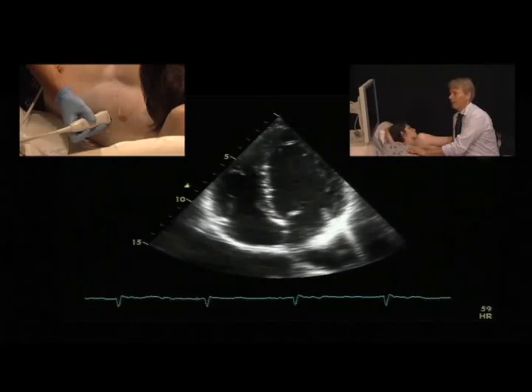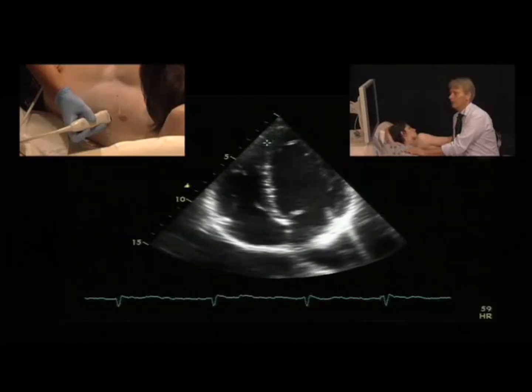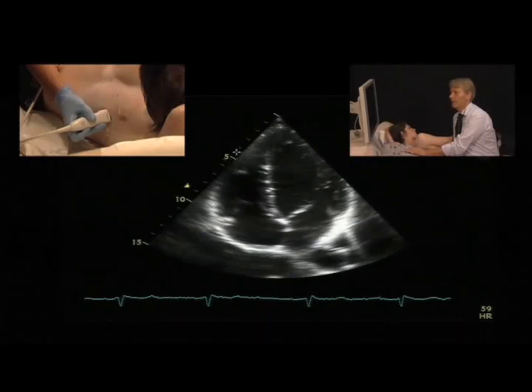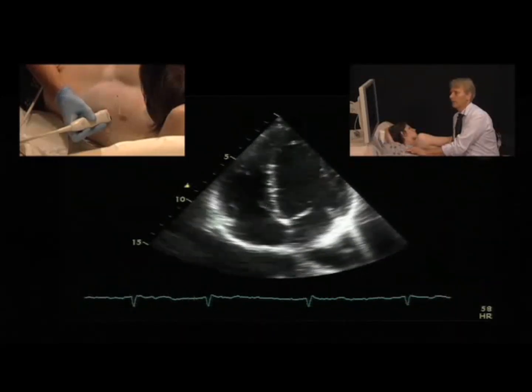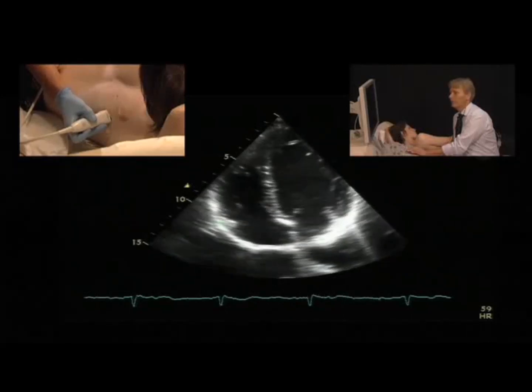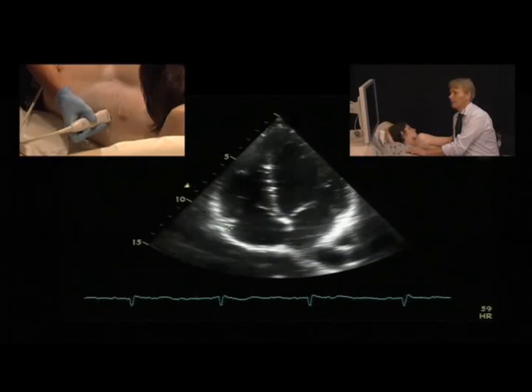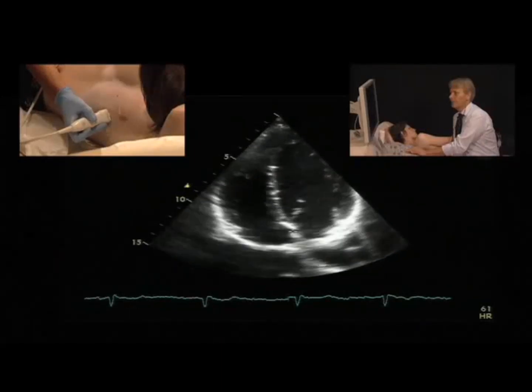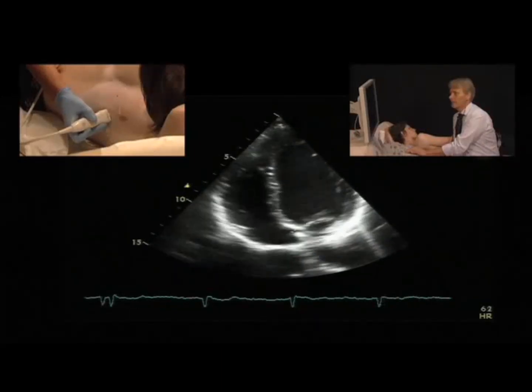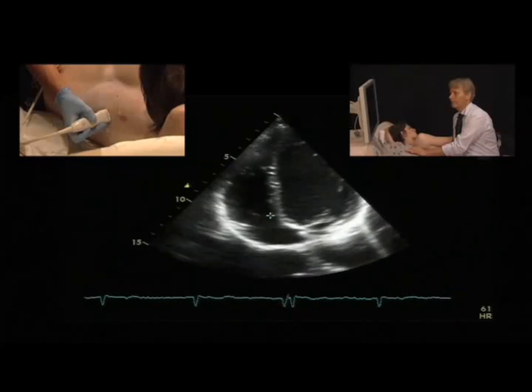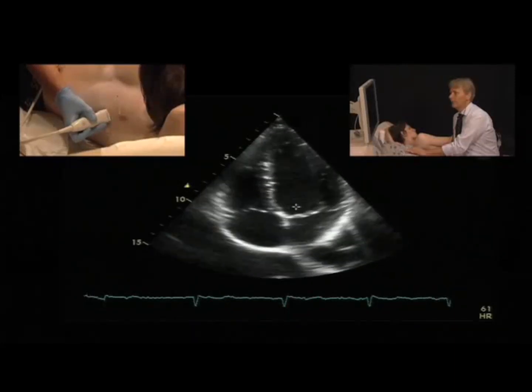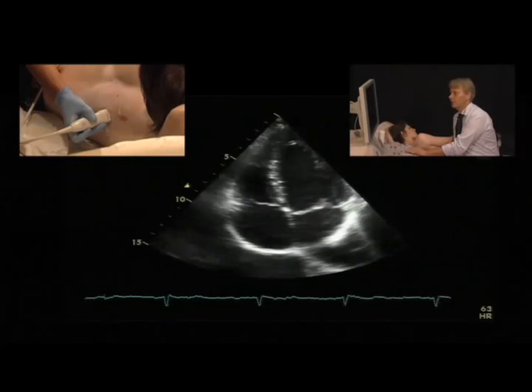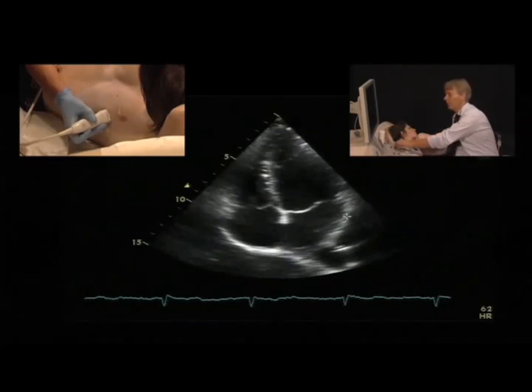In the four-chamber view you can see: the lateral wall of the left ventricle, the septum, the right ventricle with the moderator band, the lateral wall of the right ventricle, the left atrium, the right atrium, the interatrial septum with the fossa ovalis, the tricuspid valve with the septal leaflet, and the mitral valve with the anterior and posterior leaflets.